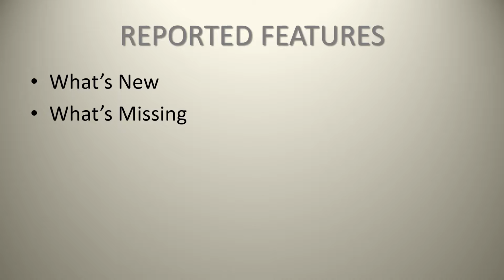But other than that, the only thing that's really interesting about this implant compared to some of the comparables is the fact that at the apical aspect, it actually will cut bone. So if you have performed an osteotomy in soft bone, and you're not careful and you're placing this implant at the torque amount, like some people recommend placing this implant around 80 Newton centimeters torque, you can actually make the implant go a lot further than where you actually intended.